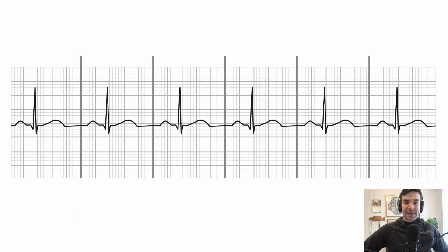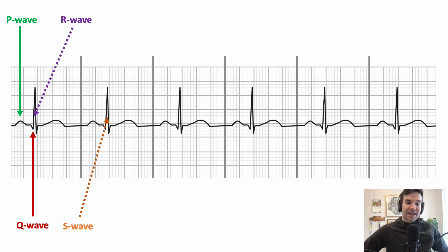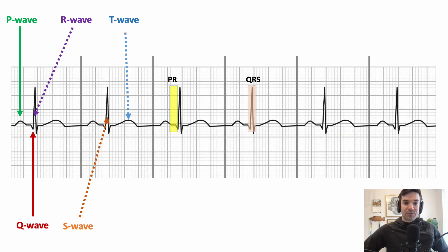Let's walk through a basic strip and refresh your memory on what all this means. First up is the P wave — you see this positive deflection — and then a Q wave, thereafter the QRS. The first positive uptick is the R wave, and then you see a negative downturn, which is the S wave, and then the T wave thereafter. There are also segments: between the P wave and the R wave, that's the PR interval; from the Q to the S, that's the QRS interval; and then the QT interval.